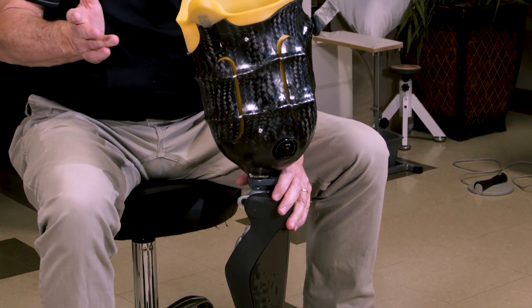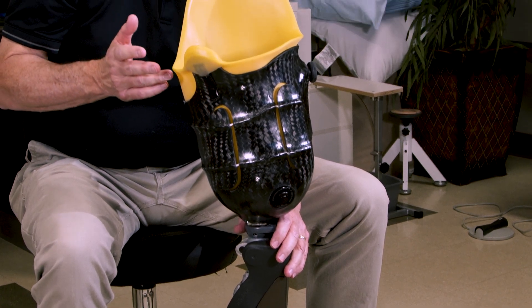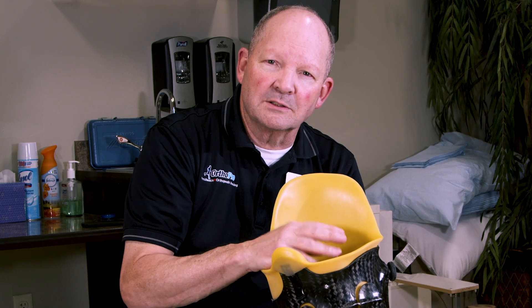One of the most important things to a prosthesis is the fit of the interface or the socket that we refer to a lot. The fit and function of the socket is so important because no matter what else is attached to it, if it doesn't fit properly it's not going to work very well.